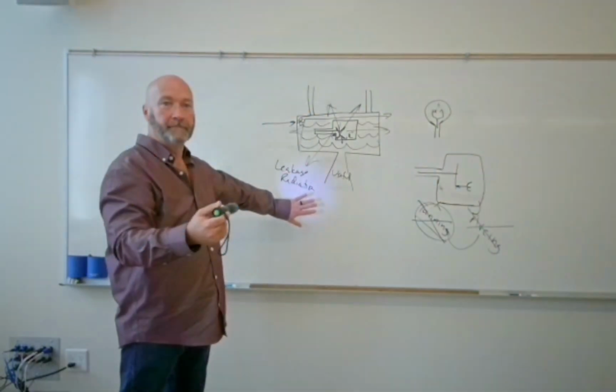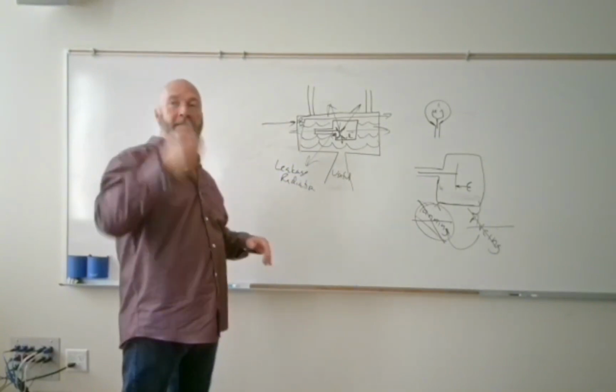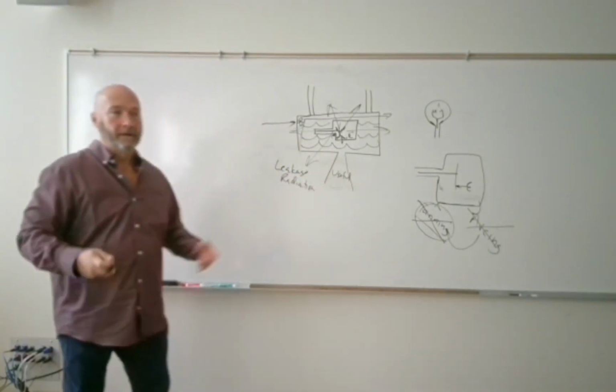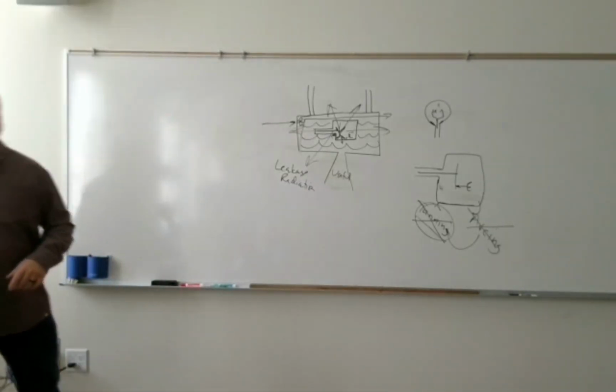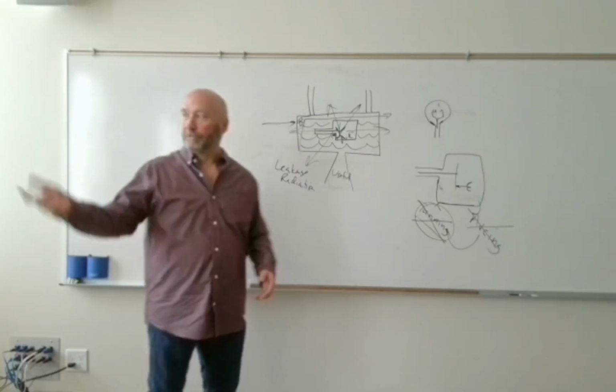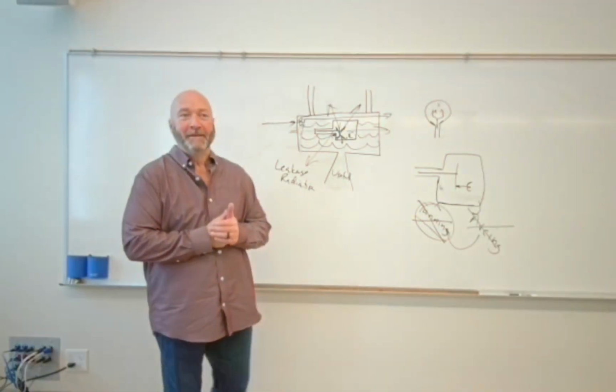Better? Yeah. So small filament, fluorescent lights, large filament, right? So detail on the small filament. And, you know, if you're making large exposures, go ahead and hit the top one again. Or Zoe would fall back to sleep on me.